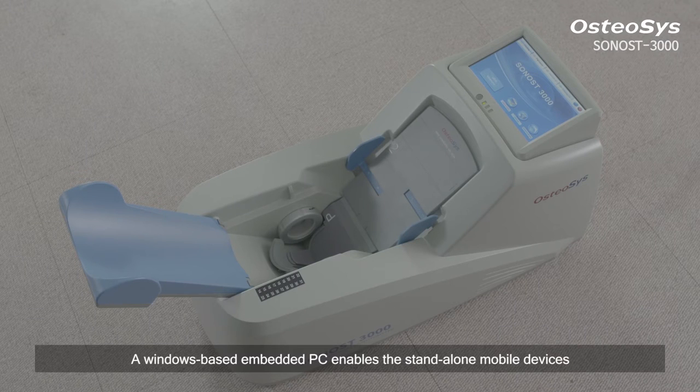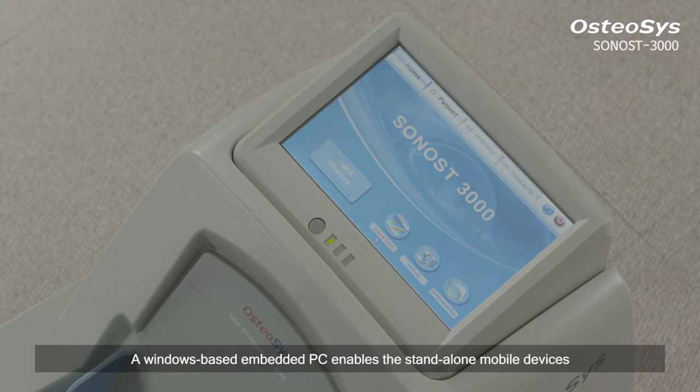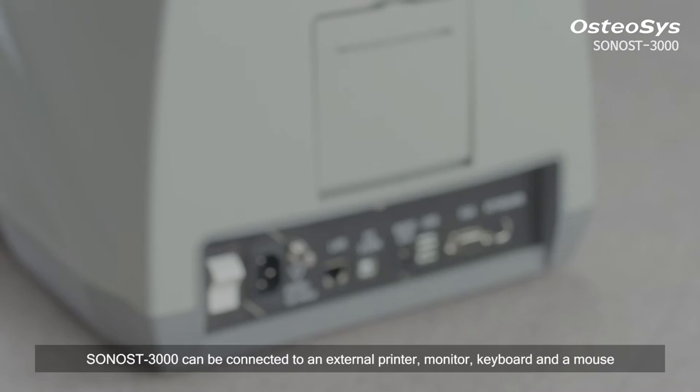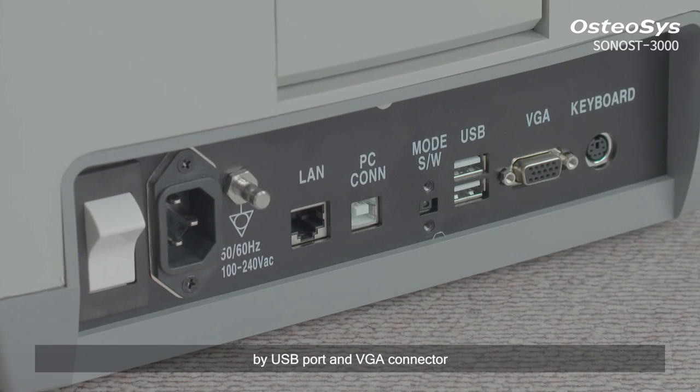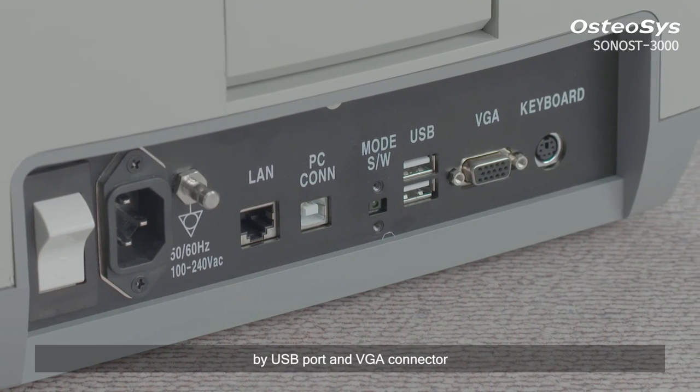A Windows-based embedded PC enables a standalone mobile device. Sonos 3000 can be connected to an external printer, monitor, keyboard, and a mouse by USB port and VGA connector.